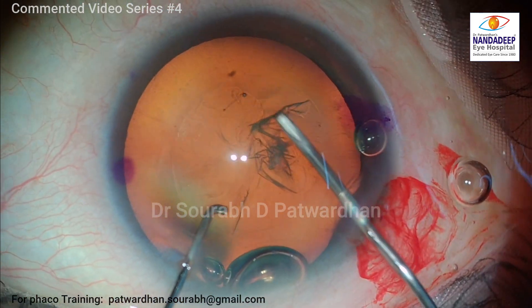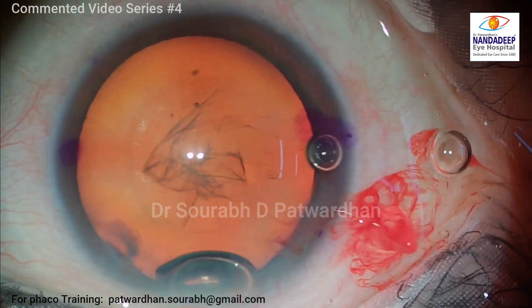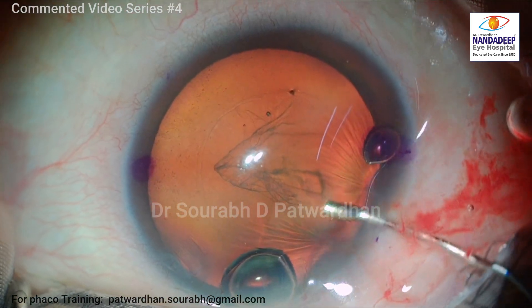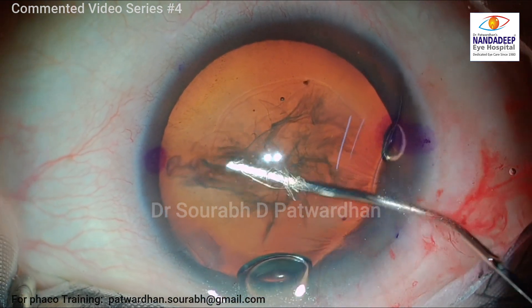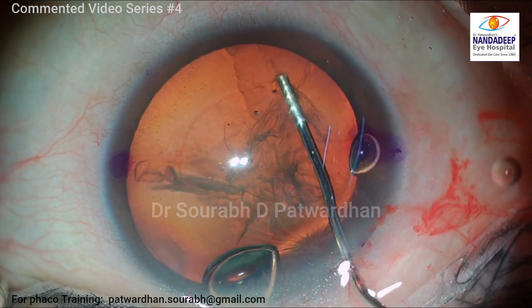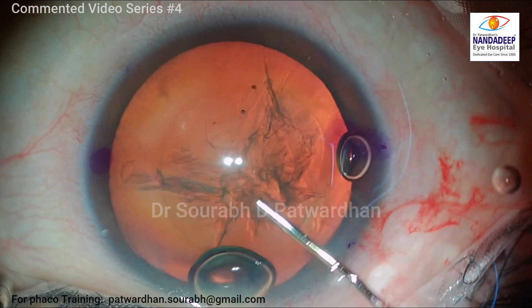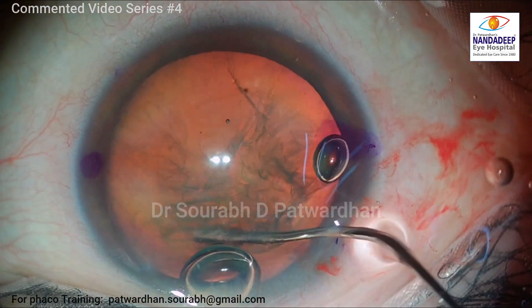Now for high myopia, if you are planning a trifocal IOL, it is important to check the angle Kappa. You can check it with various instruments. I use the ILMASTER 700 for checking it, and the value should not exceed 0.6 mm. Otherwise, the patient may have more dysphotopsias.